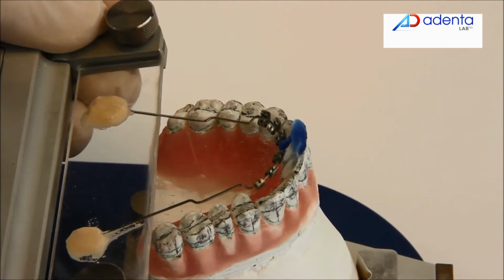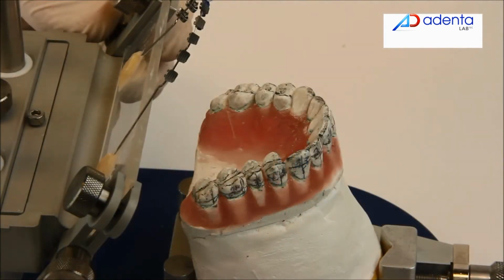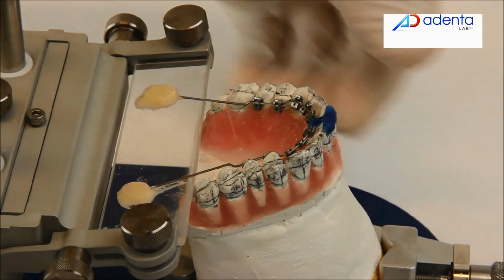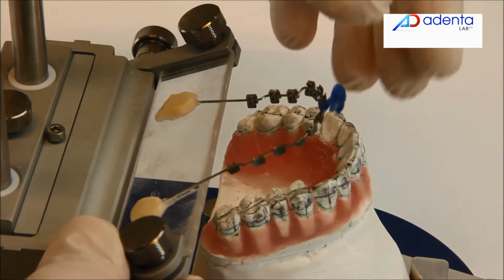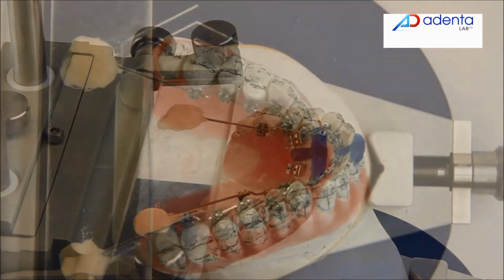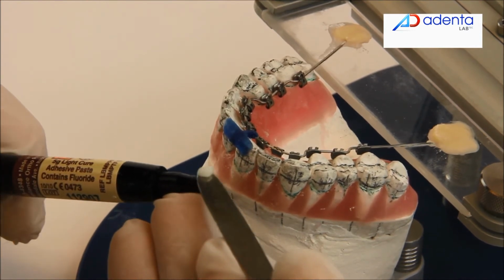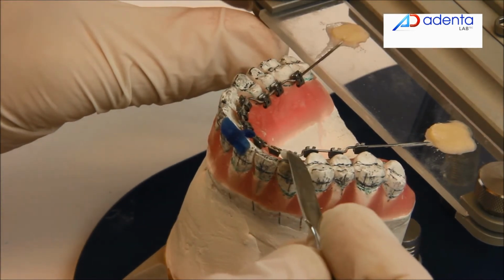Then ligate the brackets to the arch, and customize the prescription by filling the space between the bracket base and the teeth with composite. Before this, paint the teeth with the plaster separator.